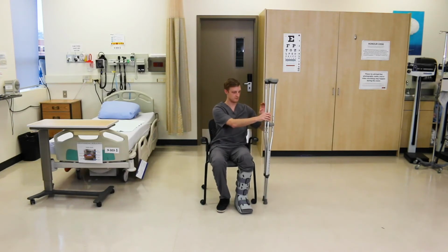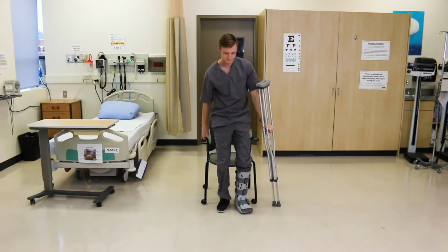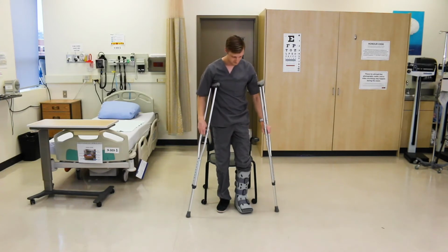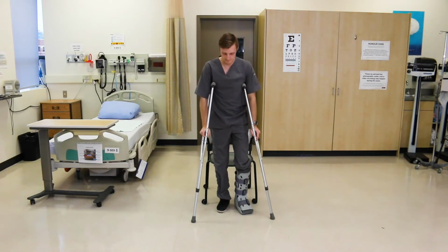When getting up, make sure the patient has the crutches in one hand and the other hand on the arm of the chair. Have them push off from the chair arm and the handle of the crutch, and stand on the uninjured leg. Place the crutches in each hand and then prepare to ambulate.